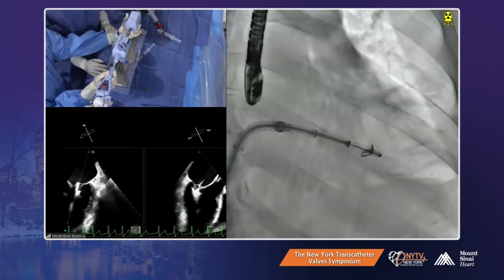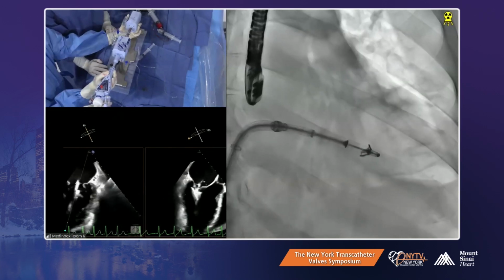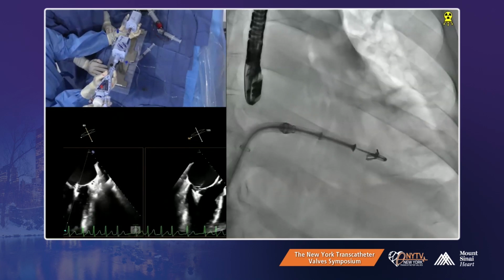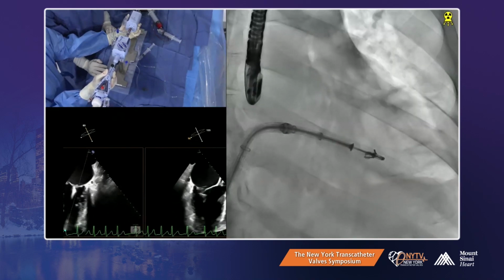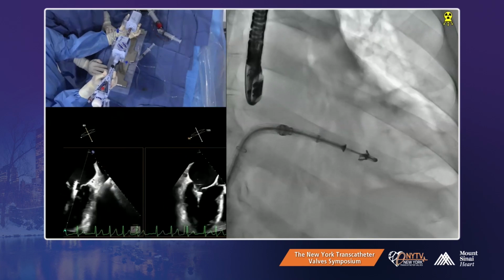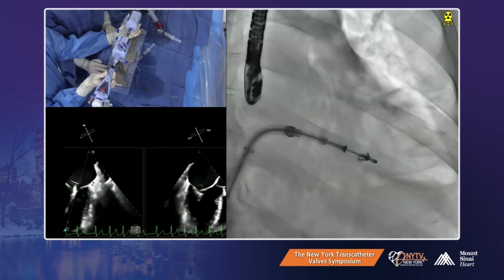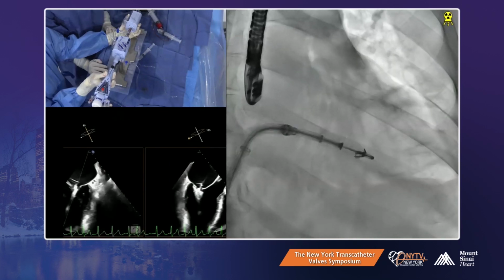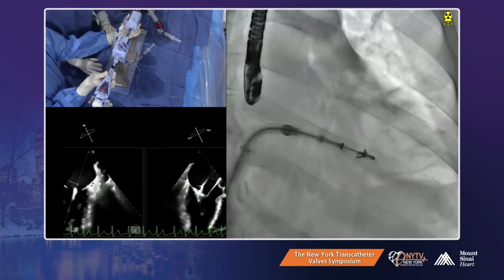So, several questions. Can you check that after your septal puncture itself with whatever sheath you have and then change it at that point? Yes, you can, of course. Once you're inside, you can actually check your trajectory. You can see where it's tenting. But at this point, it becomes challenging. I'm just thinking what correction.